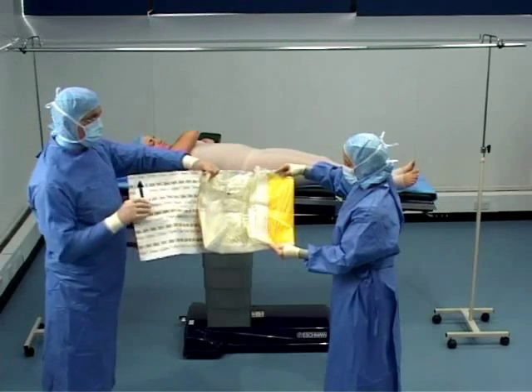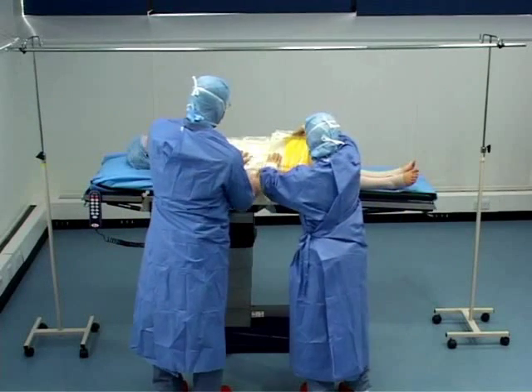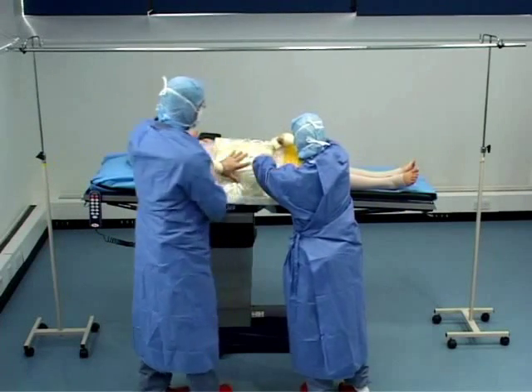The drape is positioned on the side of the patient's body in the hip area and pressed securely into place. The adhesive is strong but gentle on the skin to avoid trauma.